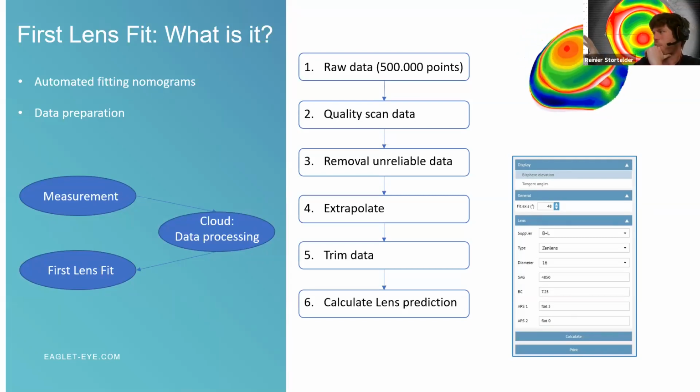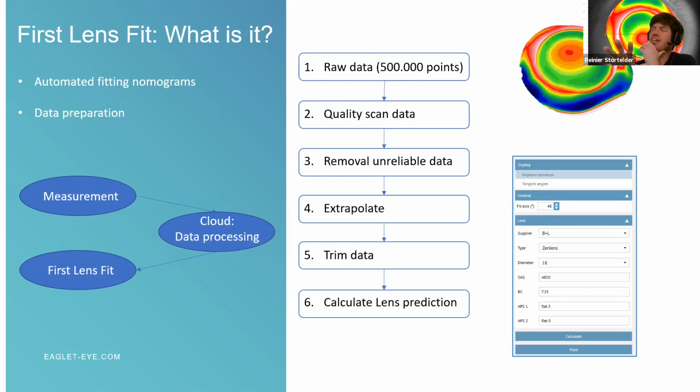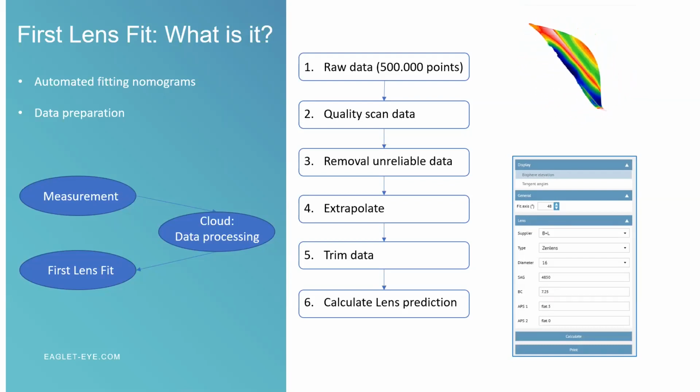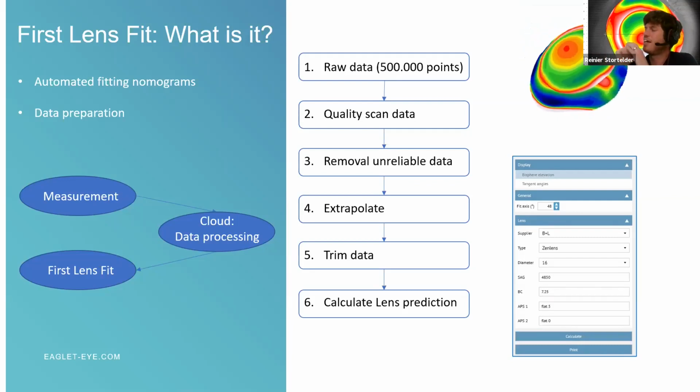What you see in the 3D cloud moving there, and first of all, you notice the red dot on the right side, which is a pinguecula. The algorithm tries to remove this as much as possible. So it tries to detect a pinguecula and remove it. Besides that, it also is trying to detect if the measurement contains the tear meniscus, because the tear meniscus may give false sagittal height data. So also this is cut off.